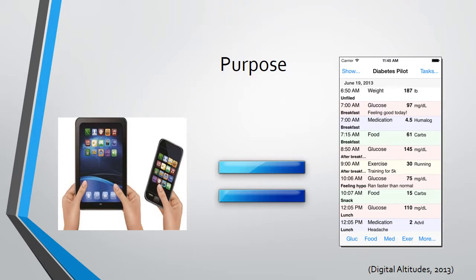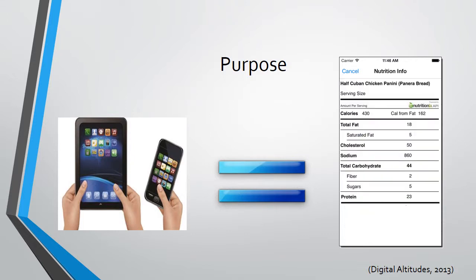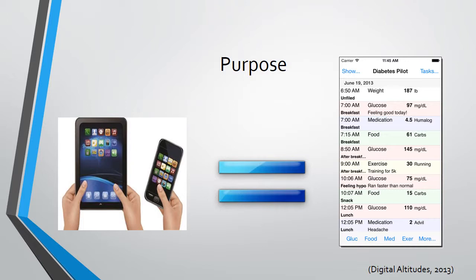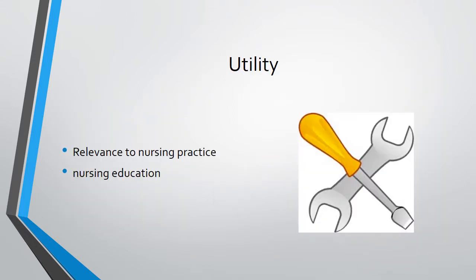The intent of this presentation is to explore the features of the mobile application Diabetes Pilot and provide an objective description of how it can facilitate teaching the patient interventions to aid in the management of diabetes. Diabetes Pilot was chosen for its affordability and ease of use. Ideally, Diabetes Pilot will assist the diabetic patient in tracking important variables related to their diabetic health, such as carbohydrate intake, blood sugar readings, insulin coverage needed, and weight and recognizing trends.